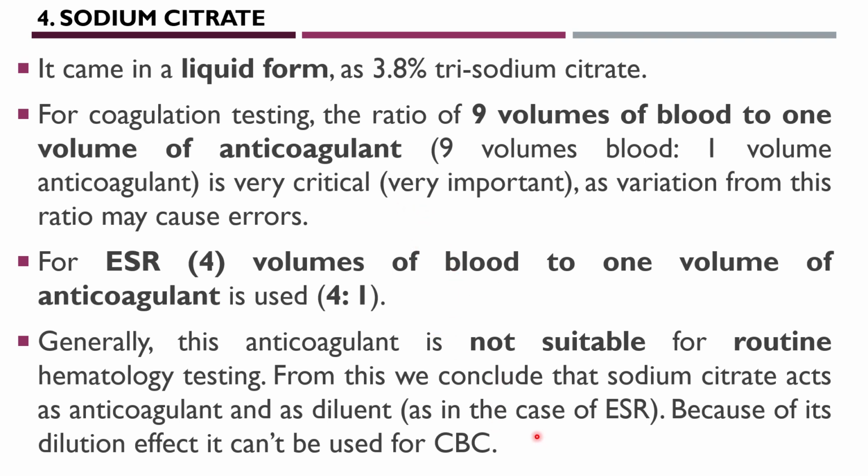Usually, the diluted anticoagulant is used for the ESR, and the other can be used for the coagulation studies, but both cannot be used for the CBC.